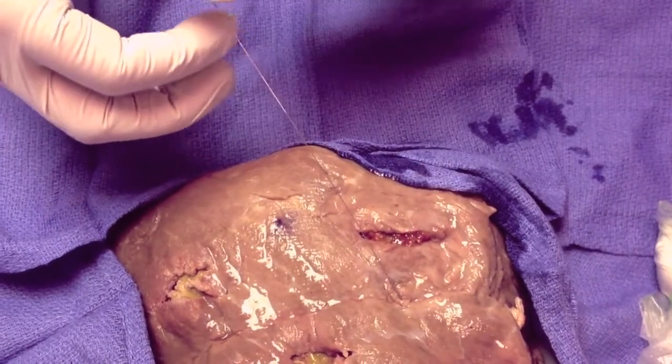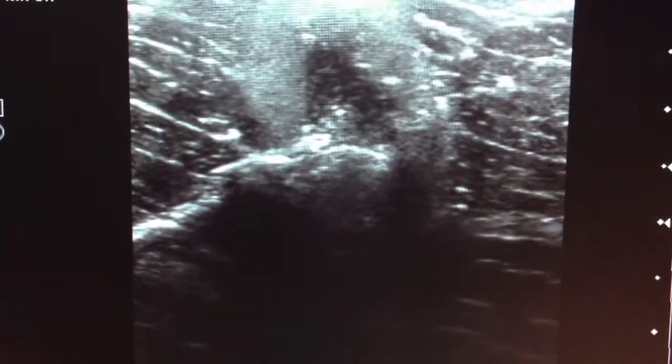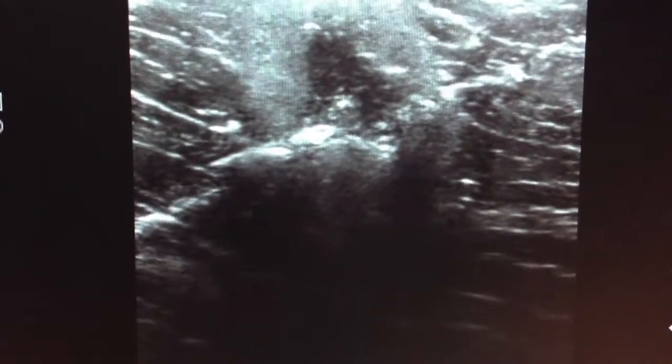Now we'll look at the image, do a quick check image, and make sure it's in the right place. And there is our little hook wire. The tip is as we wanted — just on the other side of the lesion.